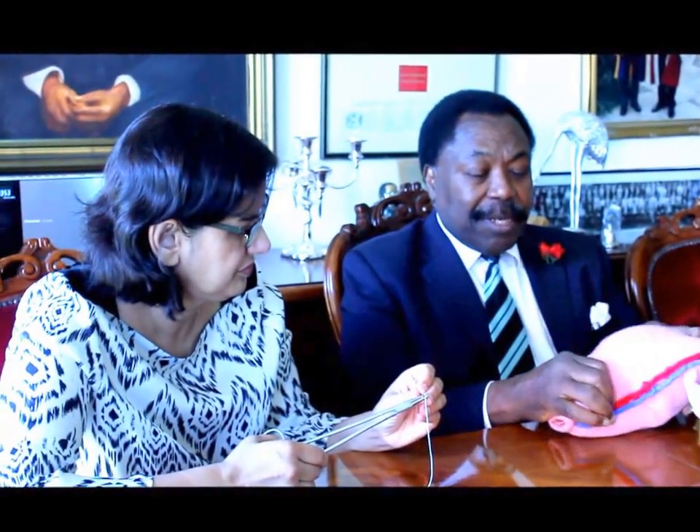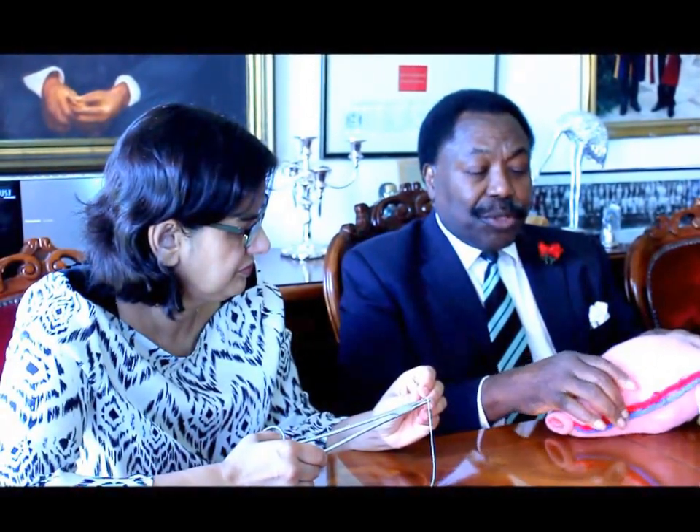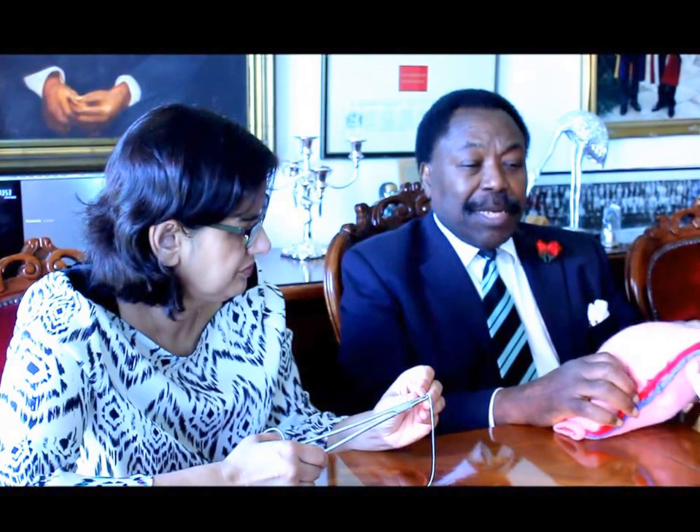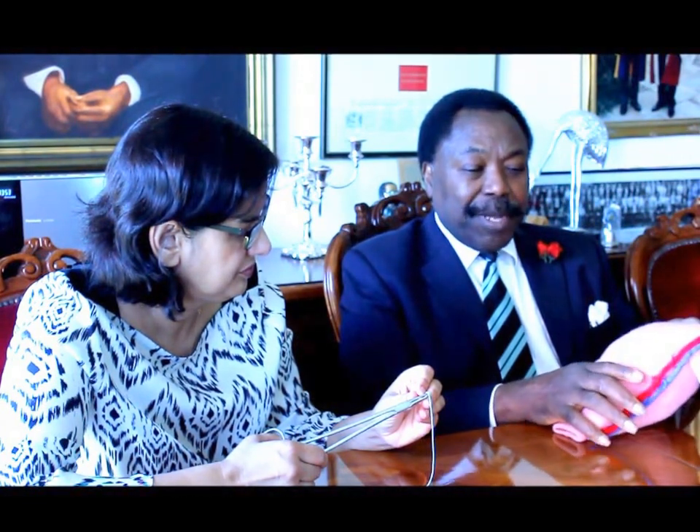After doing that, the uterus is exteriorized — brought out of the body of the patient — to facilitate easy access to all parts of the application.